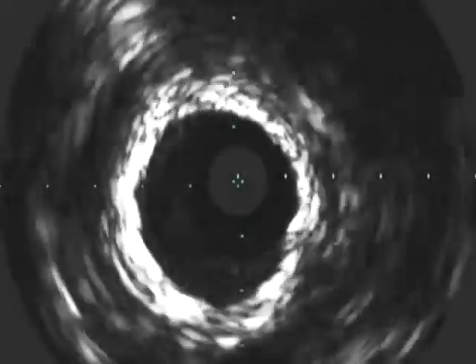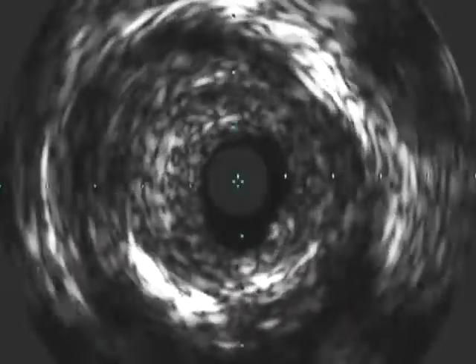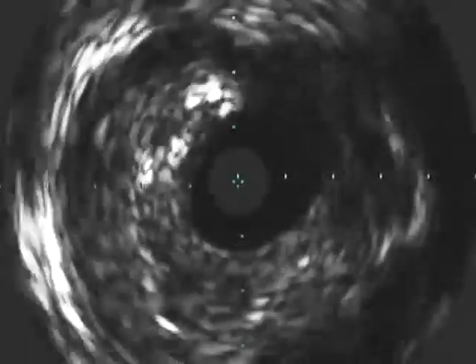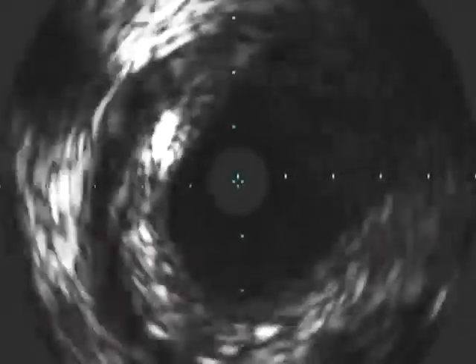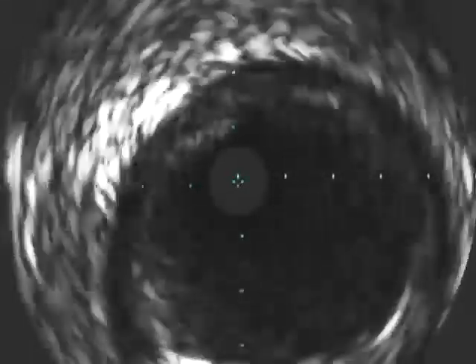The acquisition is recorded on the IVUS console while the operator slowly pulls the IVUS catheter back toward the guide catheter. This example shows severe concentric intimal calcification of the coronary artery distal to the lesion of interest. At the lesion of interest in the proximal left anterior descending artery, there is evidence of severe concentric atherosclerotic plaque with narrowing of the vessel lumen.